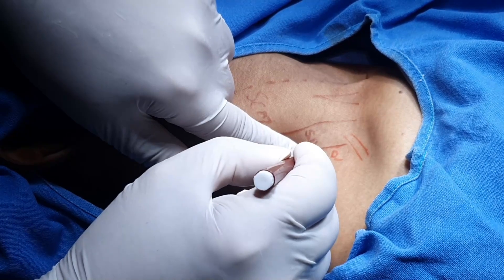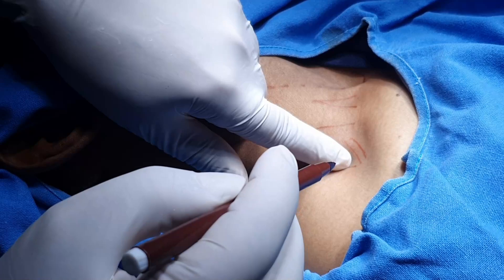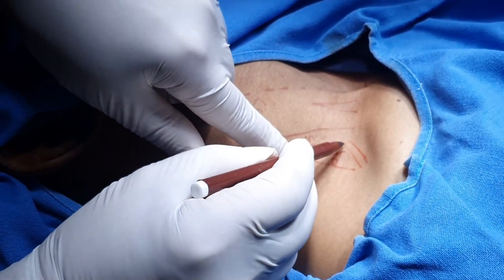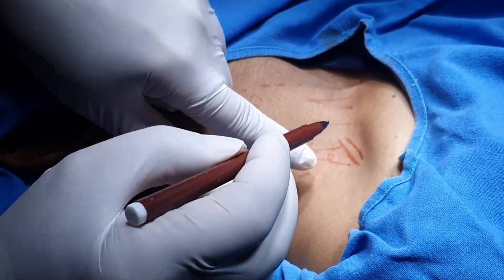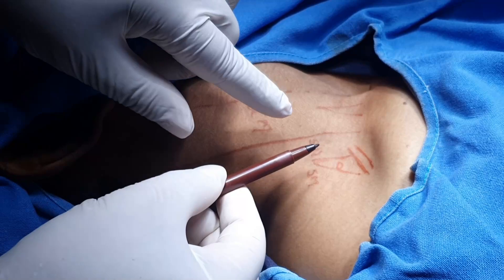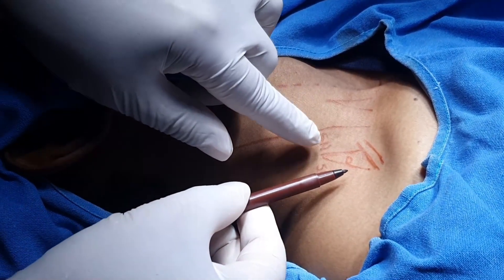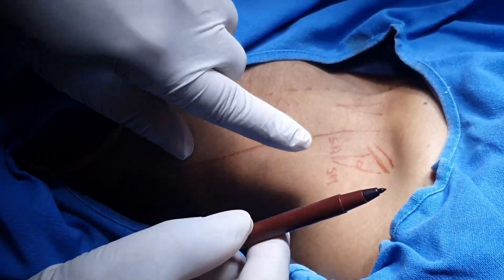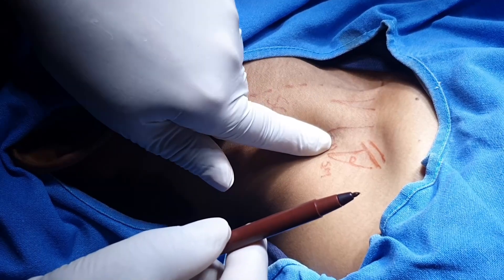Now when we roll the tip of the finger down, I can feel a transverse band — that transverse band represents the inferior belly of the omohyoid. So there is a triangle: the interscalene triangle, in between these two muscles, and the base of the triangle is the inferior belly of the omohyoid.